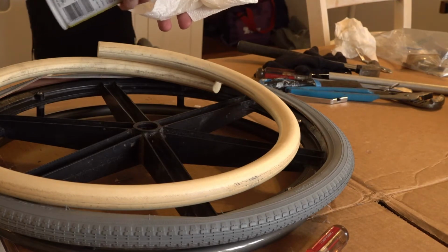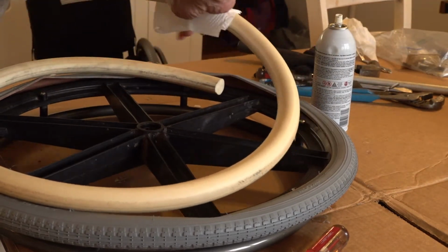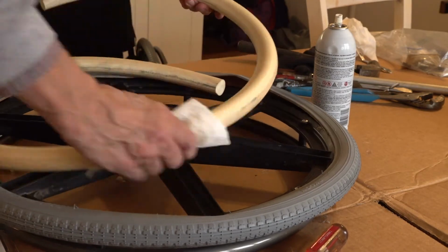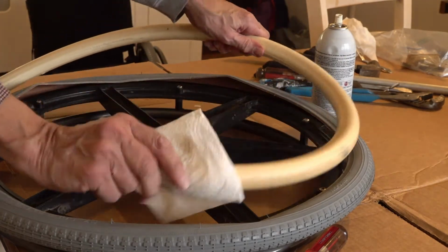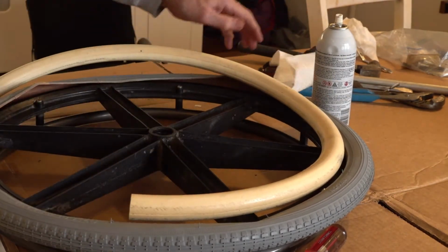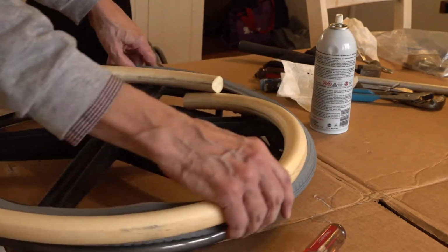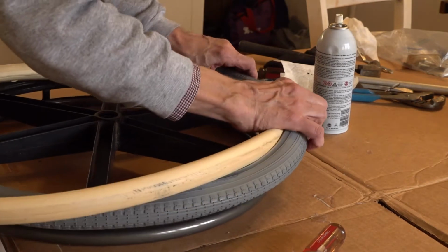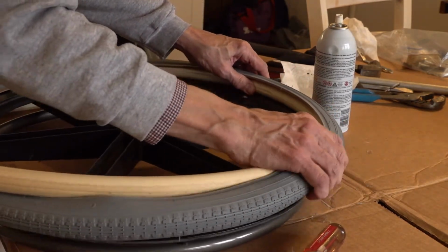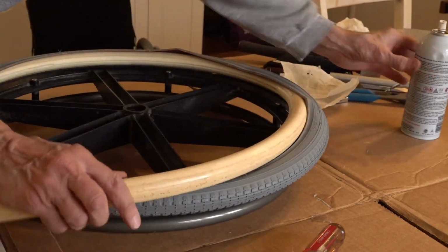Again, I like to lubricate this up with a little silicone lubricant here. And there's a little trick to this side of it, because you stick it in all the way around, back.